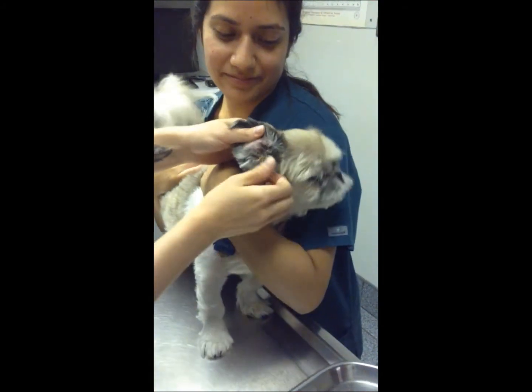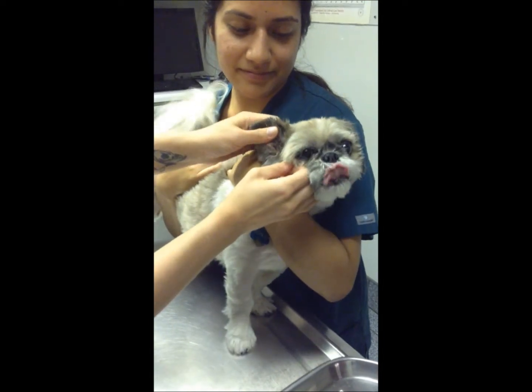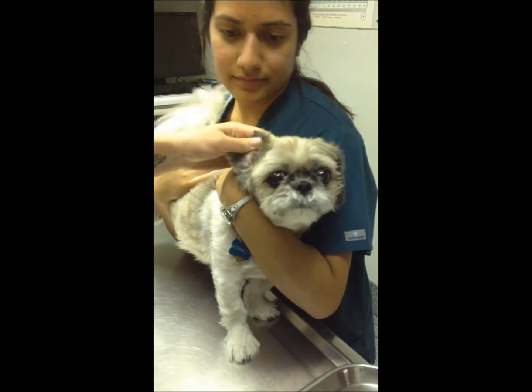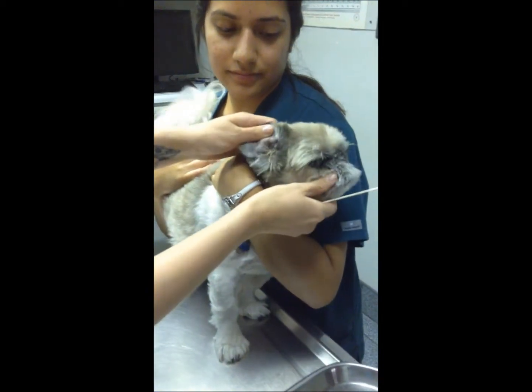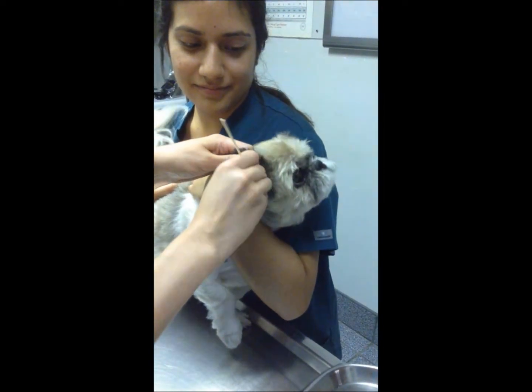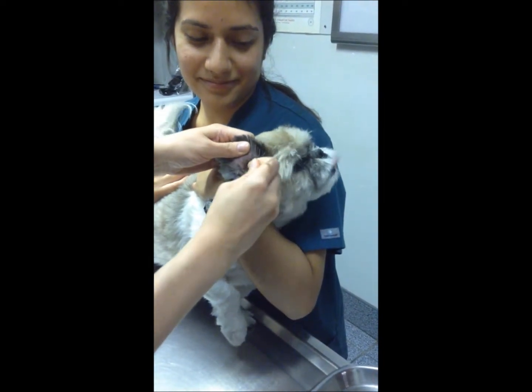So we're going to be taking an ear cytology on Francis. He has really, really bad ear issues. They're really inflamed a lot of the time and have a lot of yeast in them. So we're going to take the Q-tip and try and get a really good sample.